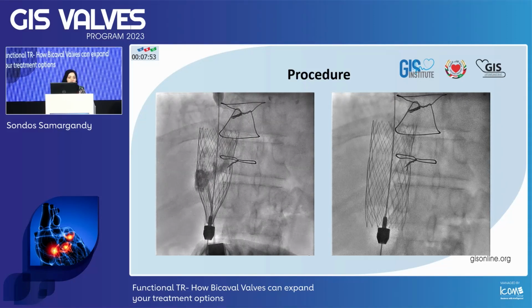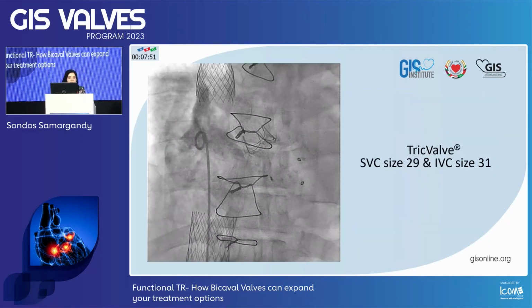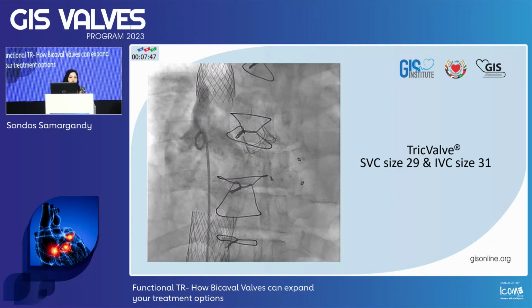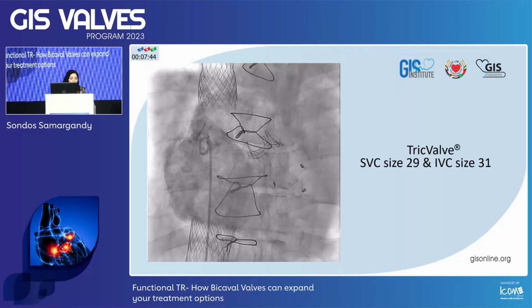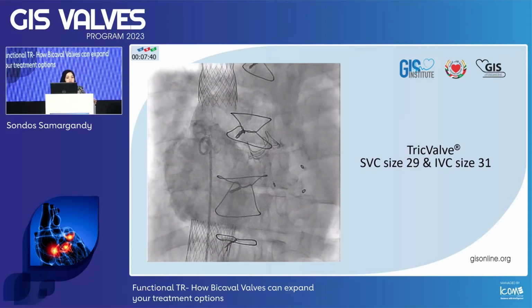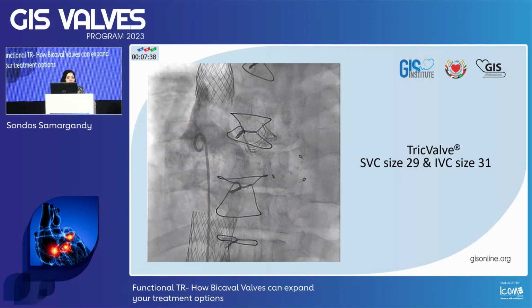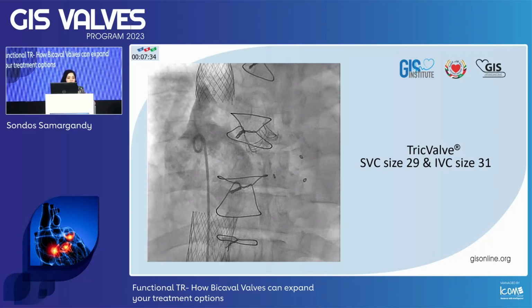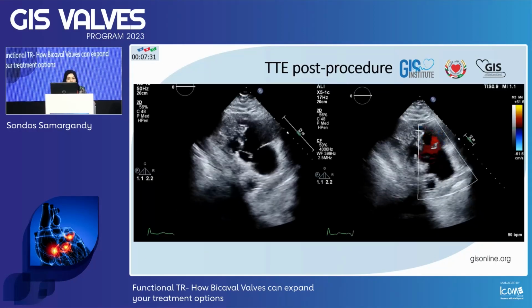deployment, and we have the transthoracic with us, and this is your picture here doing great. Everything is fine, there is no backflow going to the liver or the kidney. And this is the whole concept: you're using the RA as a reservoir, and now you're eliminating the backflow or the backwash to the liver and the kidney, and therefore protecting them.